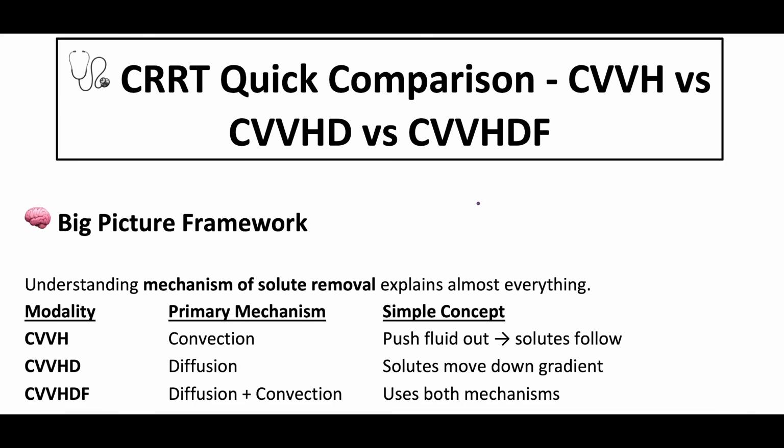Today is going to be kind of the capstone episode to pull together the last couple episodes we have had, which have been on continuous renal replacement therapy modalities, including CVVH, CVVHD, and CVVHDF. So this episode is going to be a quick comparison. It's going to list them all and compare them across different aspects of continuous renal replacement therapy. So probably very high yield and to the point.